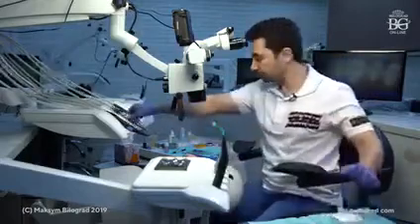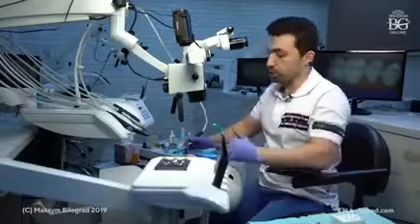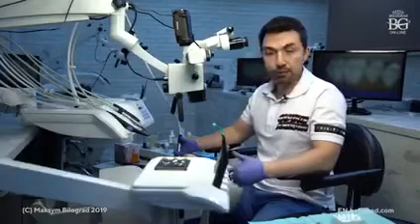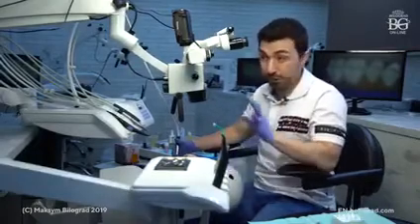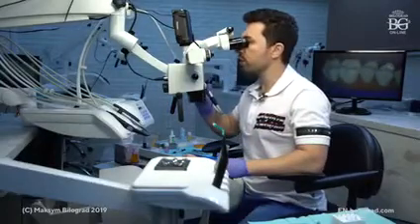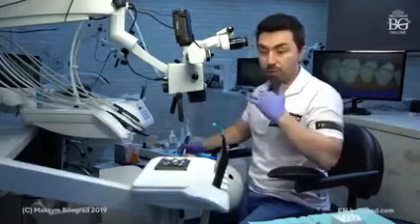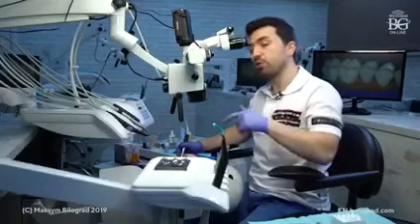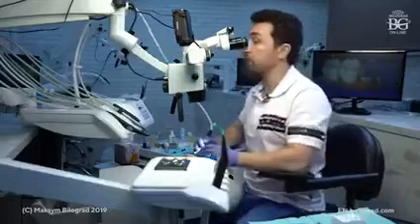So I'm going to stage 1 of preparation. Stage 1 of preparation is when you are using high speed. You can use a turbine, or an electric increasing handpiece with high speed and a lot of water, and all of your preps have to be done supra-gingival. All finish lines, considering their position in relationship with the gum, will be given in stage 2, and we will display you and then explain in detail.